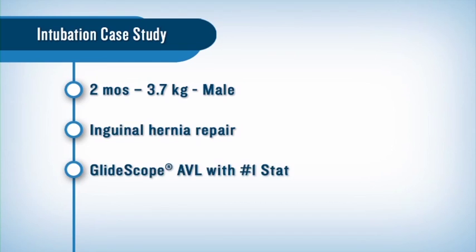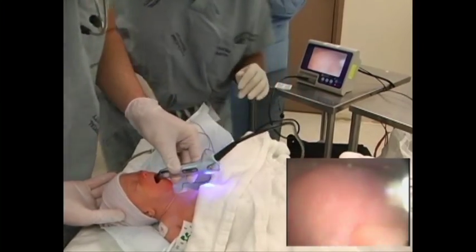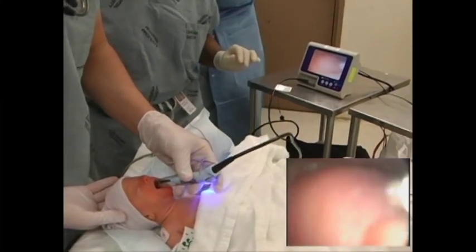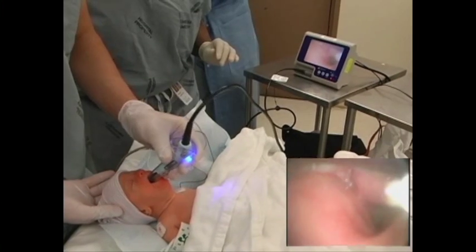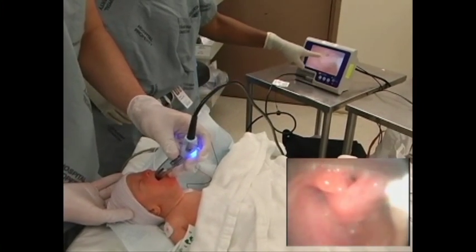We used the Glidescope Cobalt AVL with a number one stat. In some cases, placing the patient in the sniffing position may improve the view. Using a shoulder roll is another option that can help, particularly for neonates and infants.